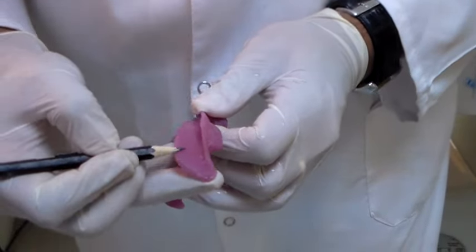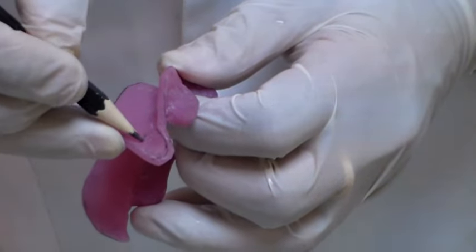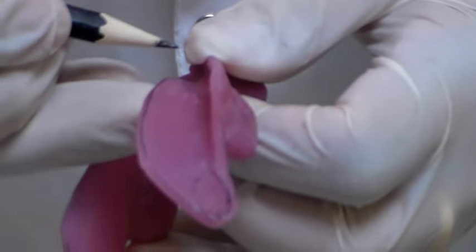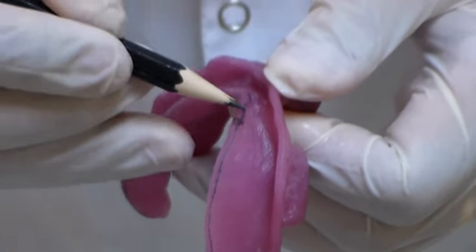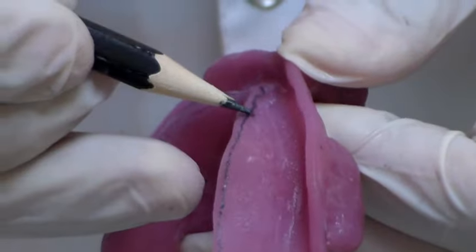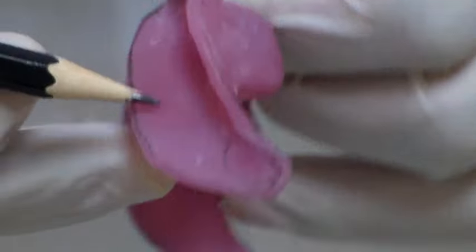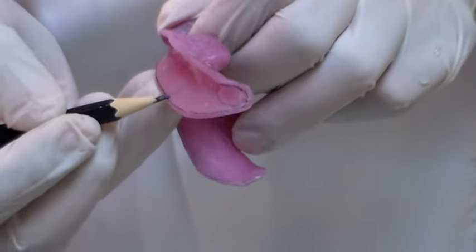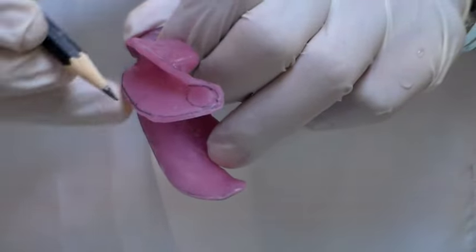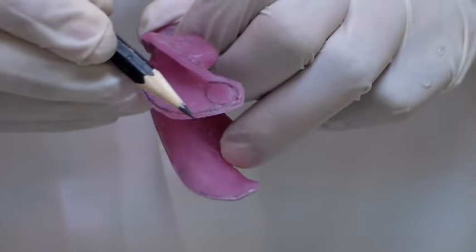This whole thing is the lingual flange, this is the retromolar pad region. The whole lingual flange from here to the other side is called the lingual crescent area. From here to here is called the pre-mylohyoid area, because this is where the mylohyoid muscle is in the mouth. From this region the mylohyoid muscle moves down to the hyoid region, so the area beyond this is called the retromylohyoid region, of which this particular part is called the lateral throat form.